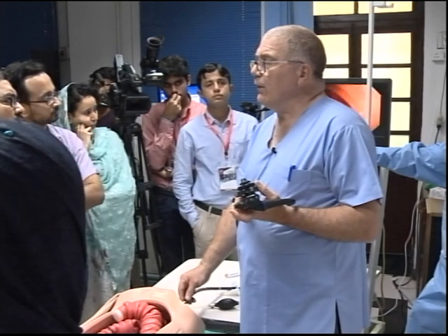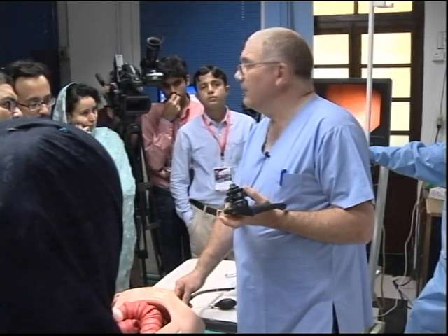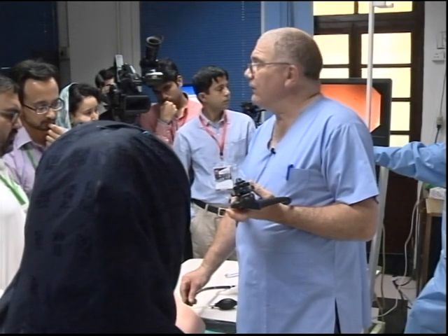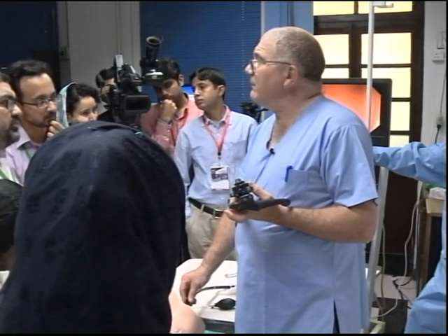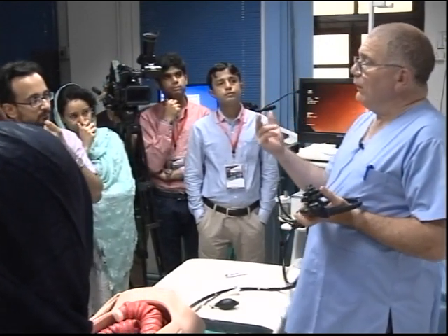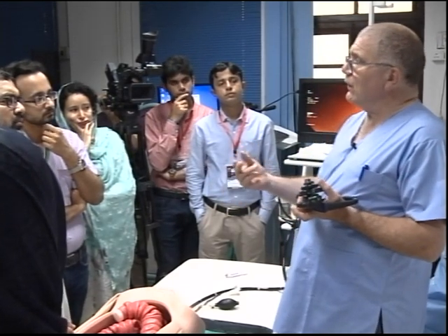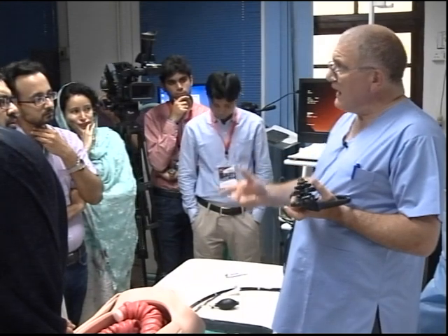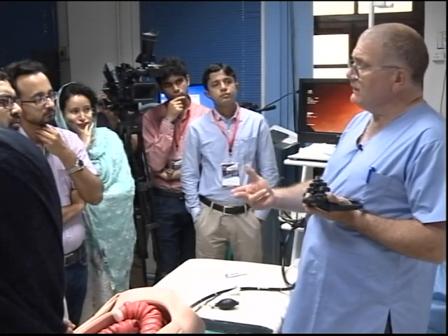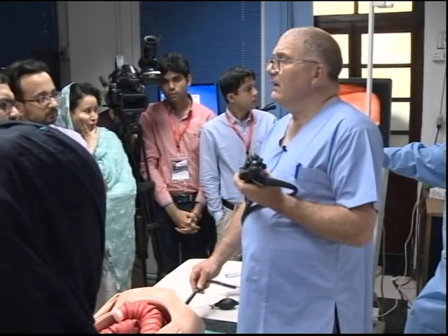It now becomes difficult. I'm putting a lot of tension on the bowel. What's my fingers just done? Now I've gone in, I've hit the wall, I've got grease. What's my fingers just done? They've slipped. So what happens is that actually helps you, stops you perforating, because you can actually go forward and it allows the finger to slip. So if you find a lot of resistance, the fingers will slip. There are times you do need to advance, and that's when you get experience. But what I'm trying to get you to understand is there is an advantage to doing it. It's better to be safe.